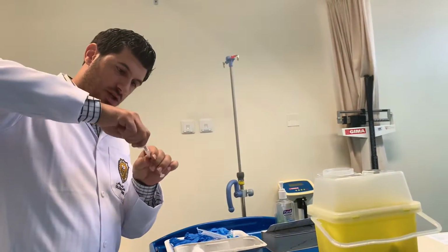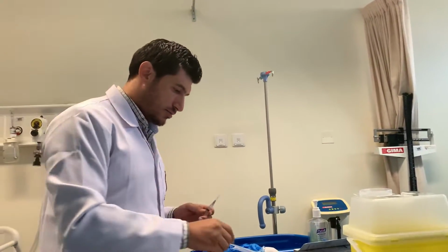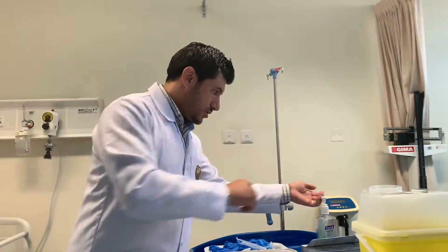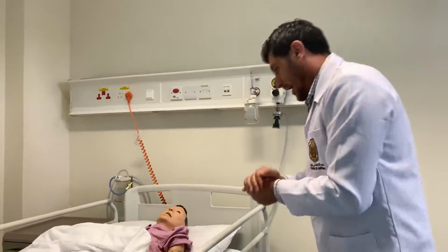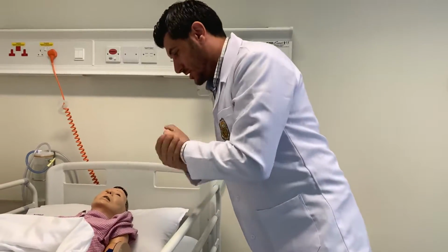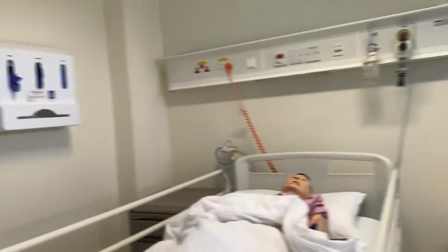So we are changing the needle and making sure that there is no bubble in it. Now I need to prepare the patient for the injection. I'm a little bit tall, so it will hurt my back to lean forward like this, so I can adjust the bed level and just elevate it.